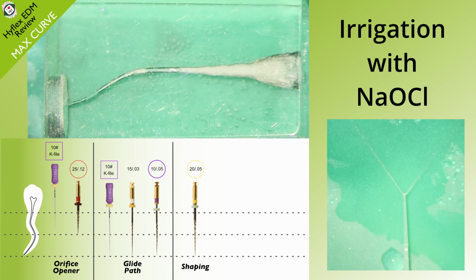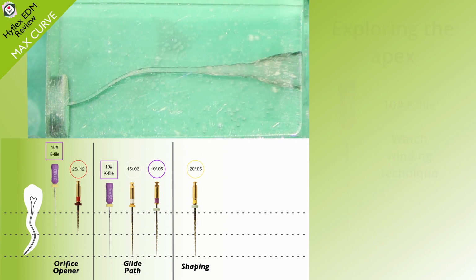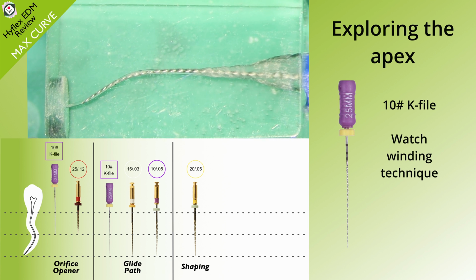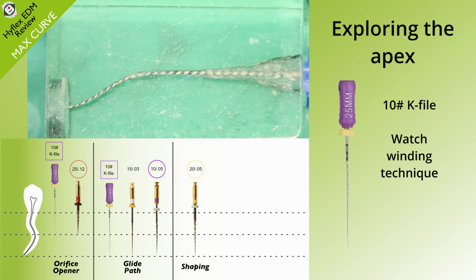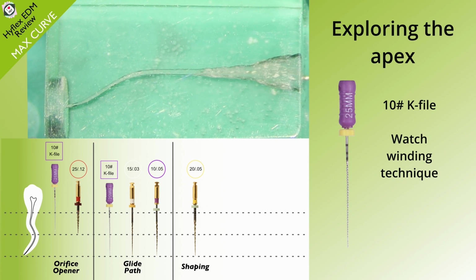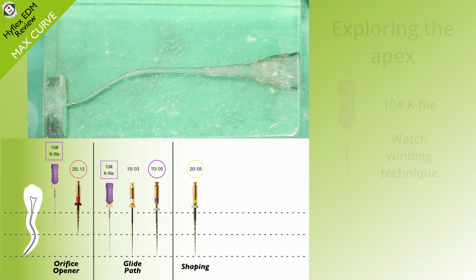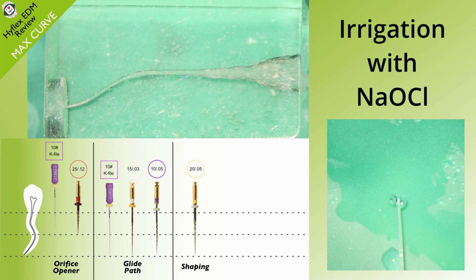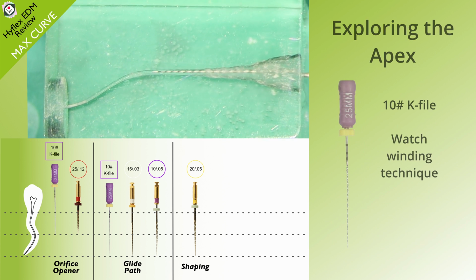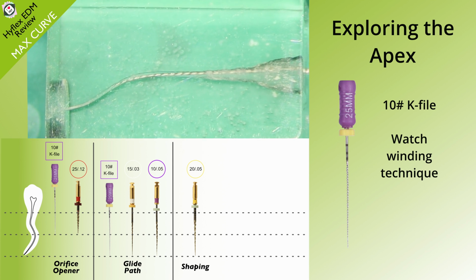Irrigation with sodium hypochlorite. And then we're going to explore the apex very carefully with the size 10K file using a watch winding technique. It's quite difficult to get around this S-bend. We've got to be really careful not to cause any ledging or transportation or a perforation. Again, lots and lots of irrigation, get all that debris out. And again, really being careful with the size 10K file, exploring the apex.